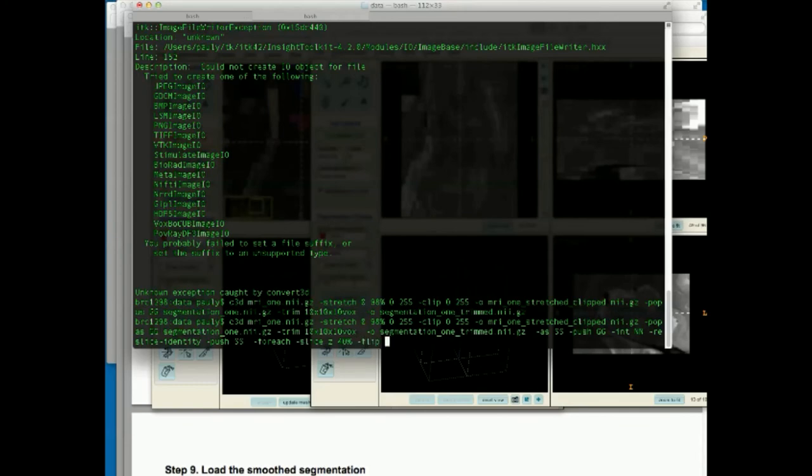We're going to flip XY. In this case, it was actually not necessary, but sometimes these images are going to be upside down, so you might want to flip. We end the for loop. So now we got those two images. We pop those two. In this case, you could do it different ways, but we are going to reverse the order, I think. That's why we're popping it.